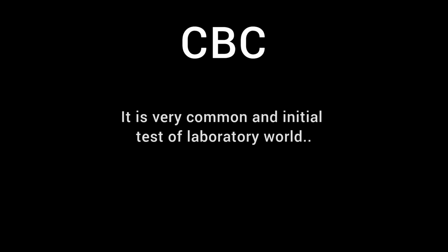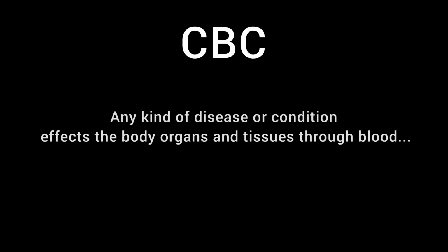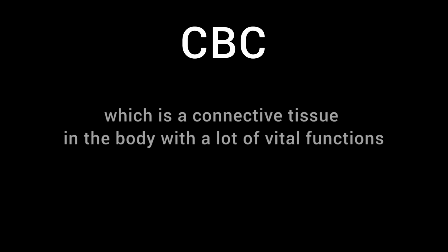CBC stands for Complete Blood Count. As the name shows, it is a complete count of blood. It is a very common and initial test of the laboratory world for the detection of every disorder, disease or syndrome affecting the human body. Any kind of disease or condition affects the body organs and tissues through blood, which is a connective tissue in the body with a lot of vital functions, including transportation of oxygen and nutrients, filtration of body waste, regulating body temperature and many others.